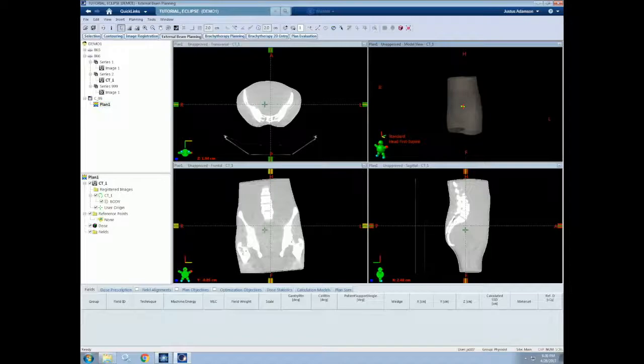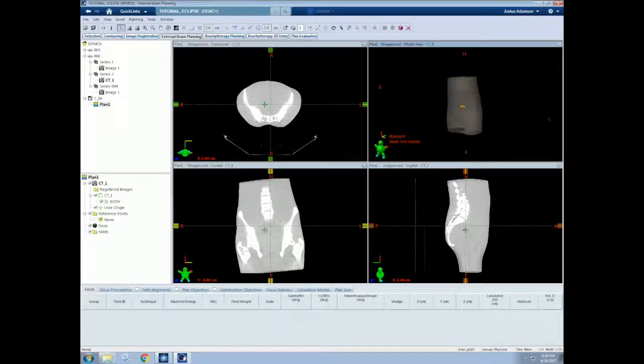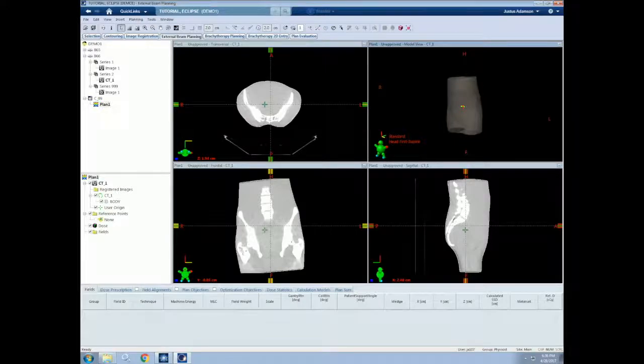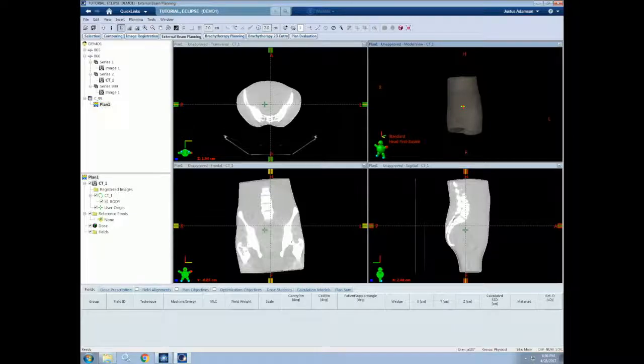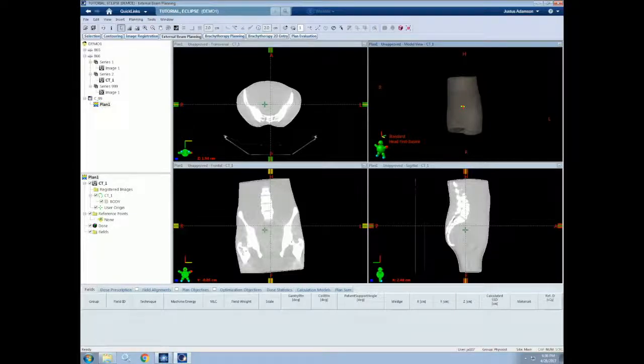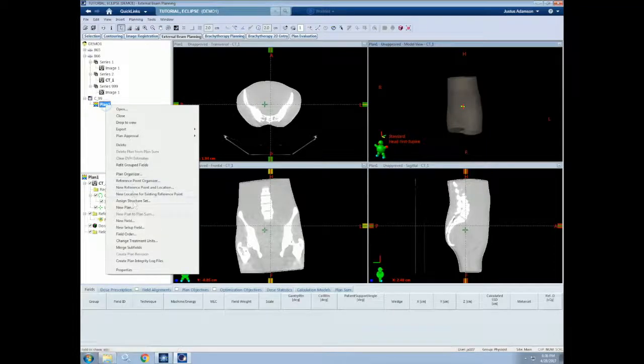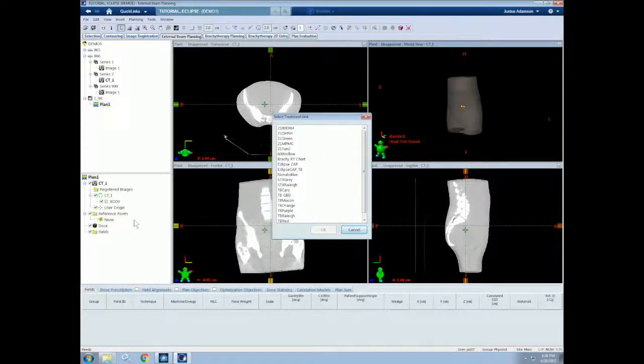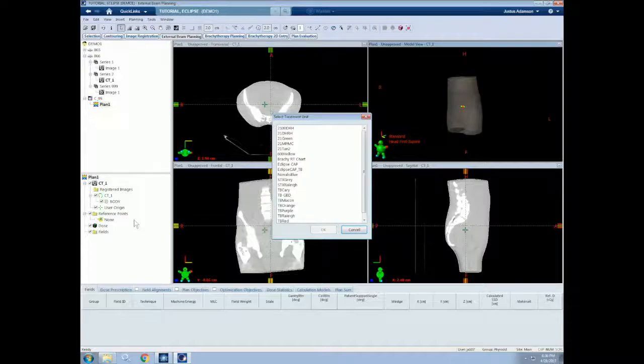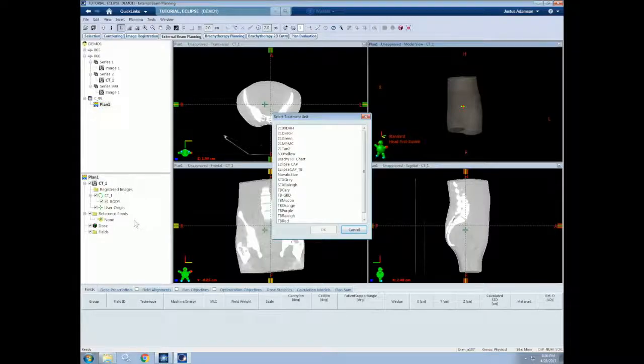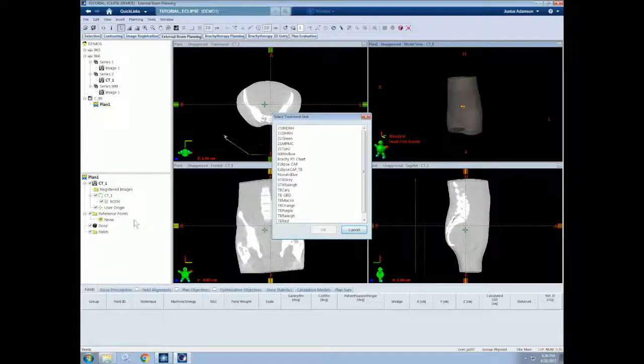Now that our plan is set up, let's create our first treatment field, or beam. I will go into treatment planning strategies in a future video, but for now, let's understand what we can do with treatment fields. To add a field, we can either go to the Insert menu and select New Field, or right click on the plan we have created and select New Field. I hope you are starting to realize that most things we want to insert into our plan can be done in a similar fashion.